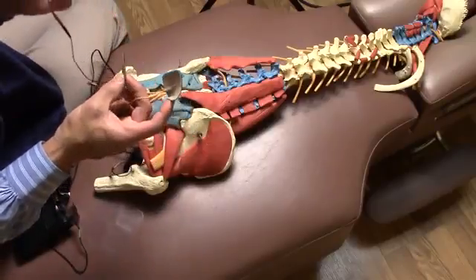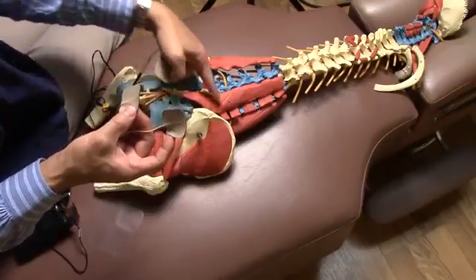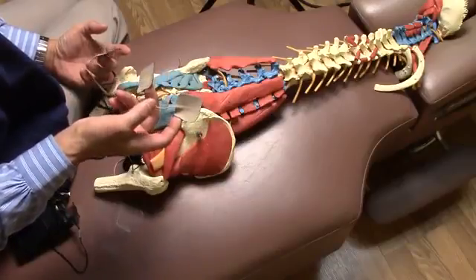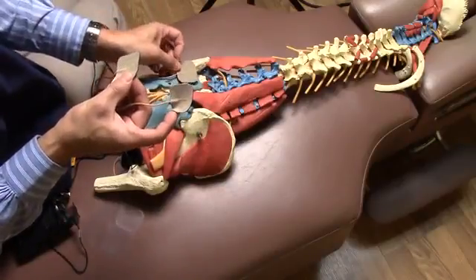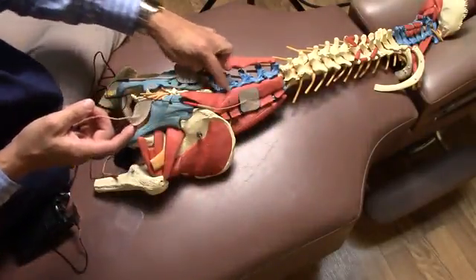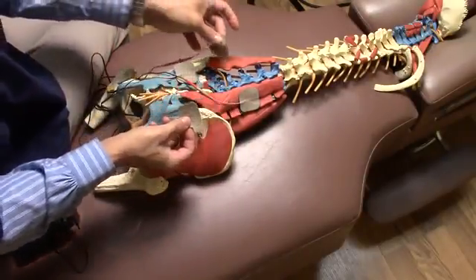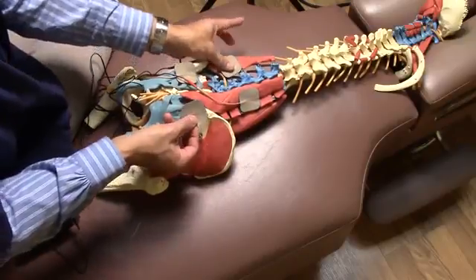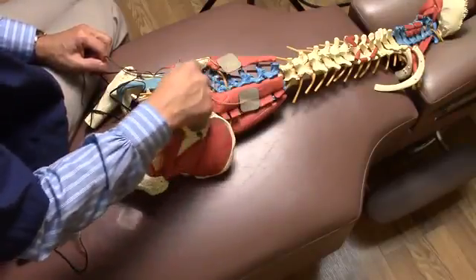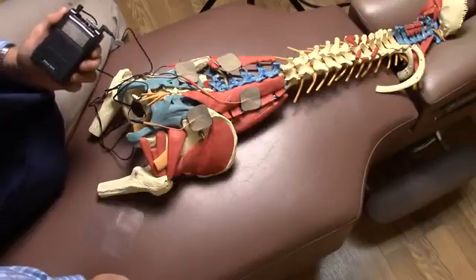You could also try using a crossing pattern with the electrodes. Let's say your pain is here, and you know when you have back pain, sometimes you don't know where the offending tissue is coming from. So you just position these electrodes around it. Just imagine these electrical currents connecting like this. So place 2 of them from one channel in that manner, and then the other 2 in this manner. Okay? So what you have here is like an X. You could play with the modulation and just see which combination works best for you in relieving the pain.